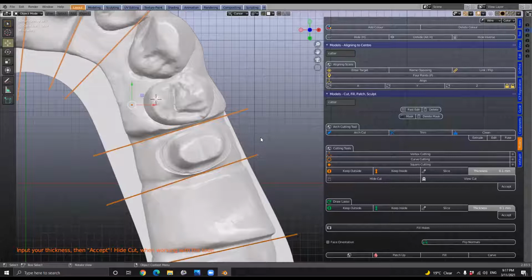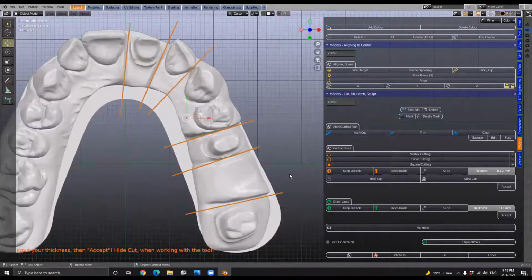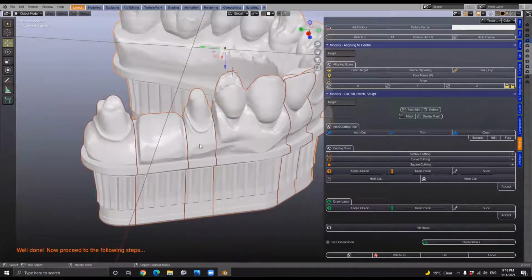So of course, if the slice is really bigger, that burn layer between the dies, mesial and distally, is not going to affect it, and you can just push the dies into the model base. But if you choose to go thin, that's okay. We're just going to have to do a small adjustment on the mesial and distal side of the burn layer after you've printed that. I'll take a piece of sandpaper and give it 2 swipes. I think it's about 120 grit, and that layer is then gone. But we've got to be careful. We don't want to get rid of the burn layer on the buccal and the palatal aspect, because this is part of our clipping mechanism.